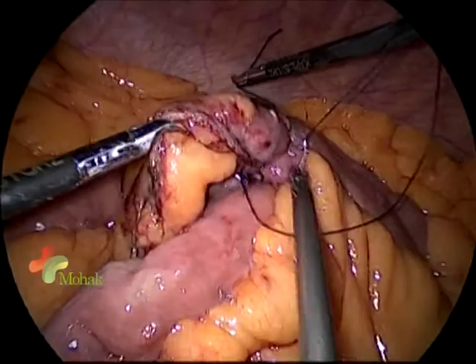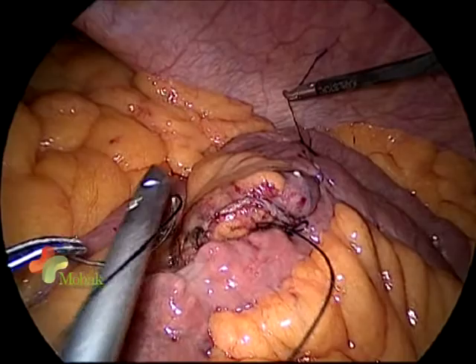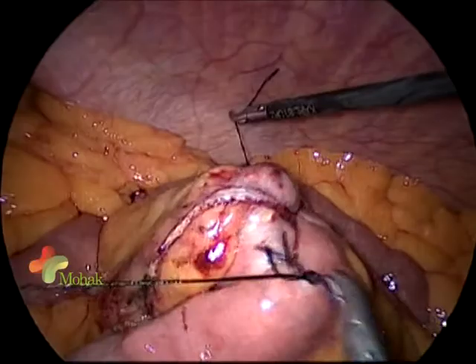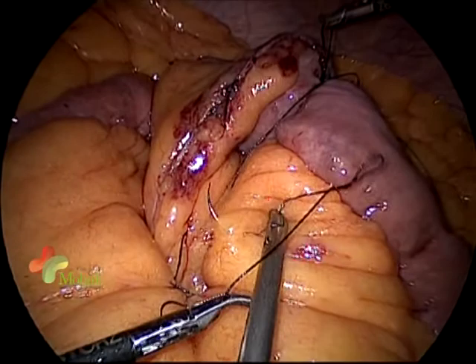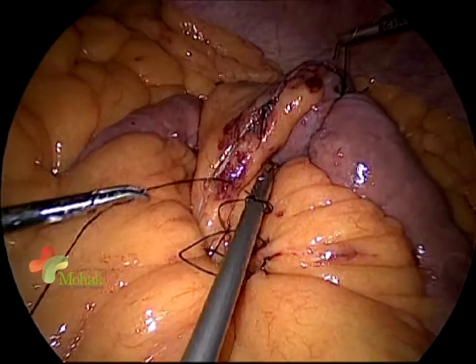One should not compromise on the principles of closing defects and suturing — follow the same principles as in open surgery, always in two layers. We will close the mesenteric defects using silk, a non-absorbable suture. This defect must be closed compulsorily because there can be a chance of internal hernias.